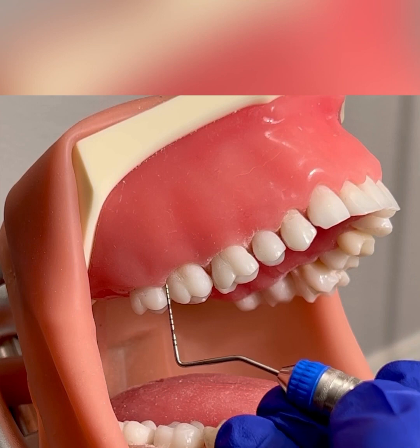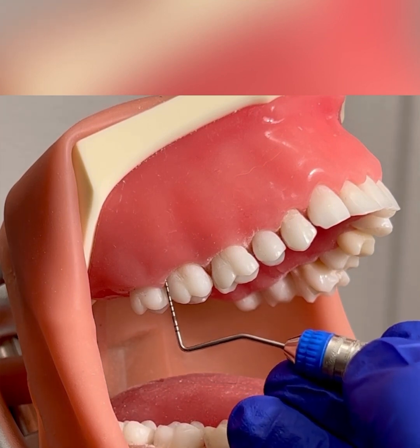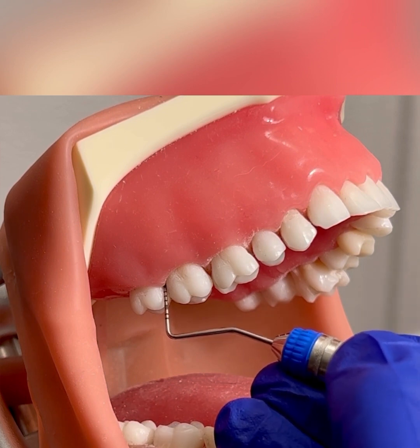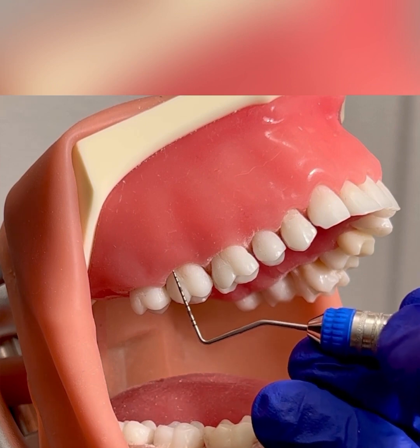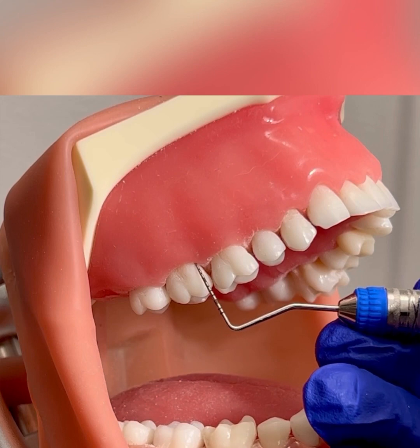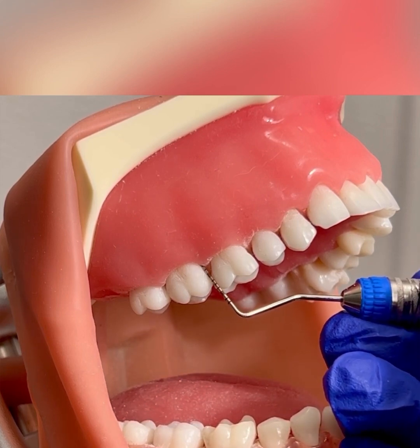After tooth number one, you will go to tooth number two. Again, start at the distal buccal line angle, walk the probe to the distal and proximal, angle your probe into the col, continue walking across the buccal surface, staying adapted, maintaining your modified pen grasp and walking into the mesial.